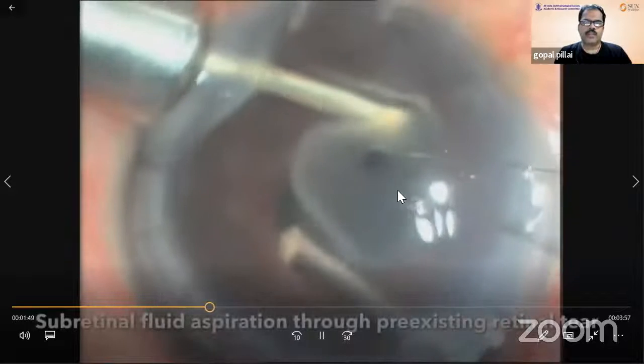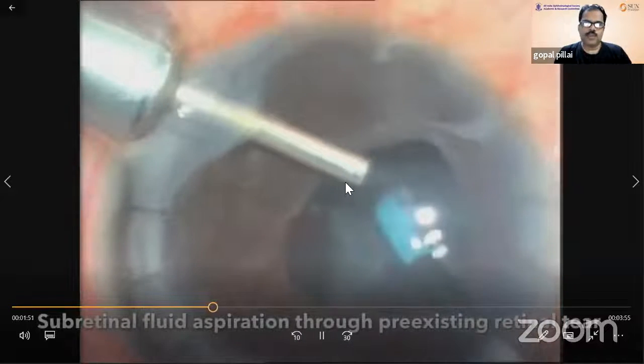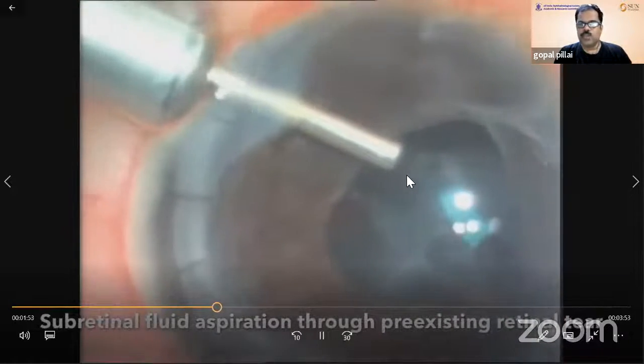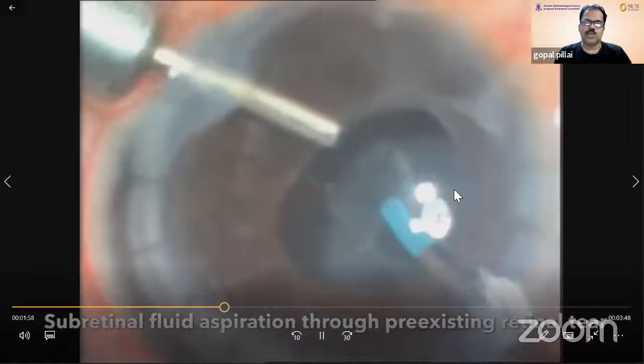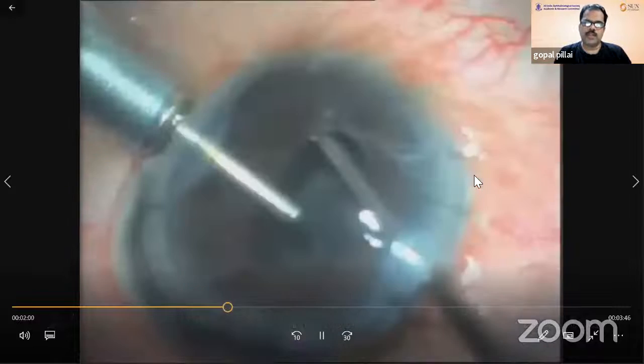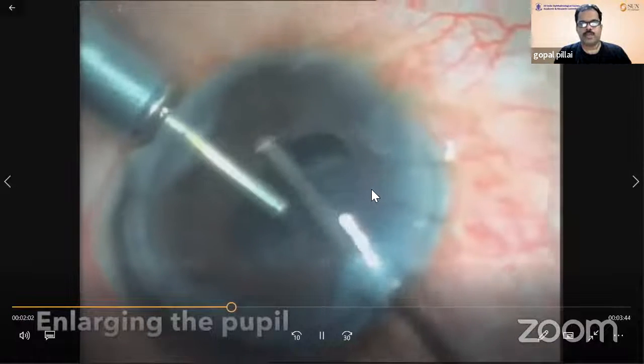So here there is no maneuvering space. So you are basically using whatever space is there to cut the vitreous, but you can see that here there's a tear also here. And you can see whenever we are trying to do any vitrectomy, the fluid is going through the tear to make the retina more bullous. So we are using a silicone tipped instrument to remove that subretinal fluid.